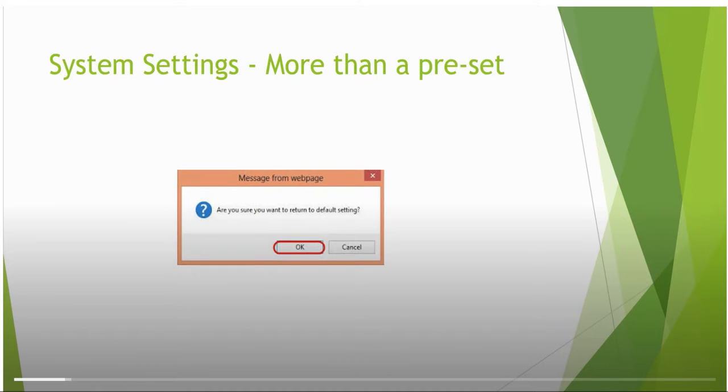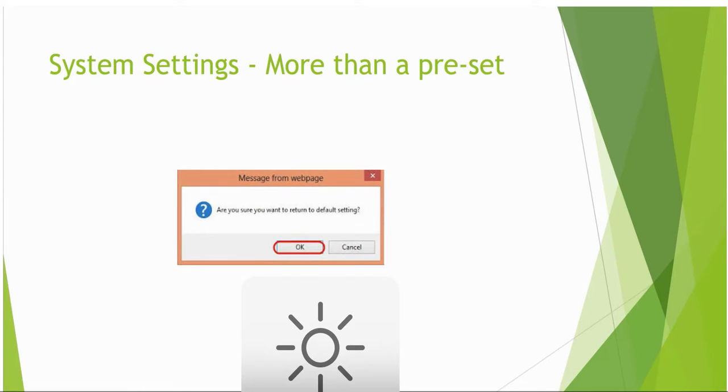had difficulty working on a new machine because the system did not have the presets they want. While to some degree this is true, a system can be set up very poorly. Generally, all machines have a default setting you can go back to which aren't horrendous to use. What we should consider a preset to be is a starting point, not often the same place we end at.